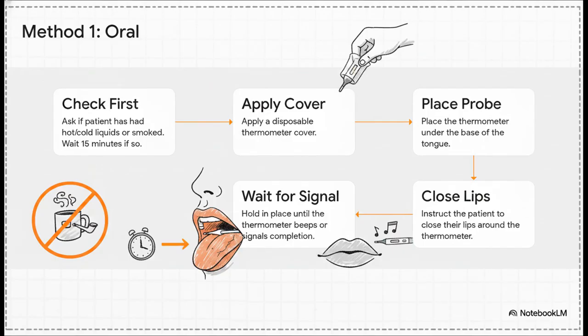First up, the oral method. This one's super common. But before you start, you've got to ask, have you had anything hot or cold to drink, or have you smoked in the last 15 minutes? If they say yes, you have to wait.